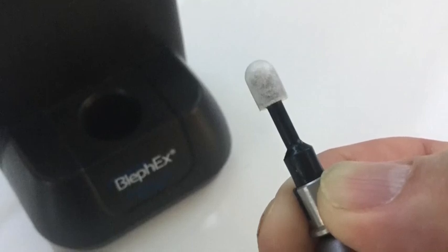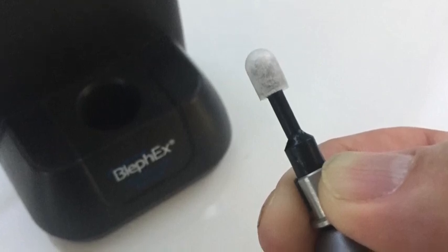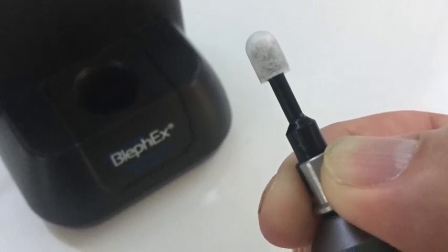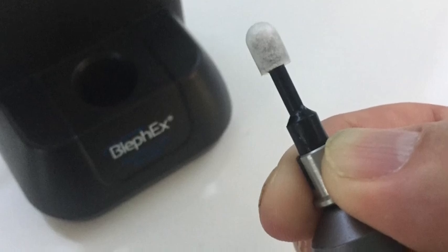Okay, here's a word of caution. When you remove the tip, make sure you support the stainless steel chuck that the tip is sticking into. Support that with the other hand. We've had practices that after doing hundreds of procedures, they remove that tip, just pull it out. The chuck would stick on the end of the tip and it goes in the trash can and they have to get a new unit. So support the chuck.